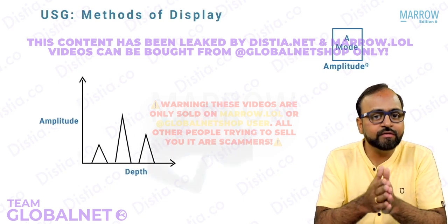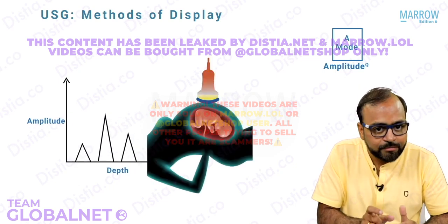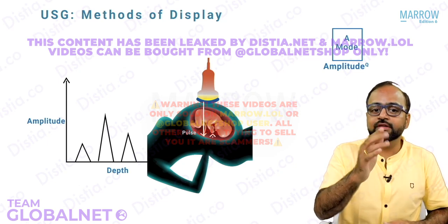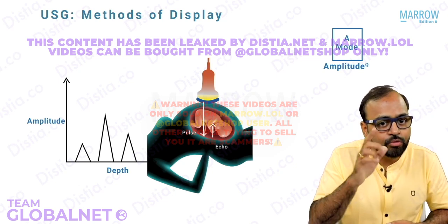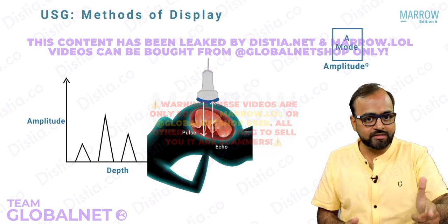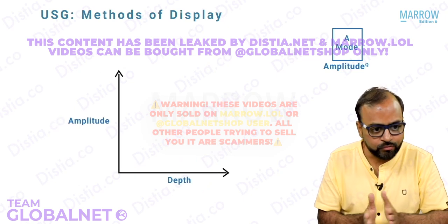Right? Now see, when we do the pulse echo principle, I said that using the formula, we can calculate that depth that is plotted on the x-axis. But when the echo is received, the machine is going to measure the amplitude of that particular echo, and that amplitude is plotted on the y-axis. So this is just a graph of amplitude against depth of origin.